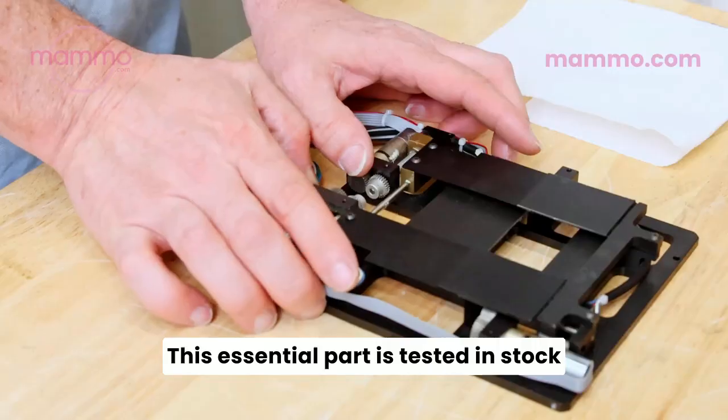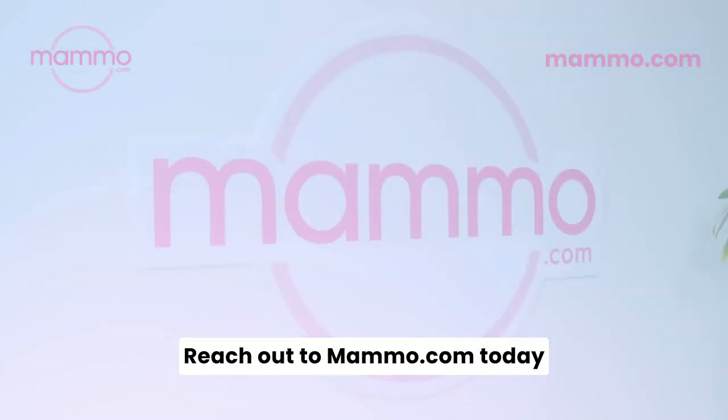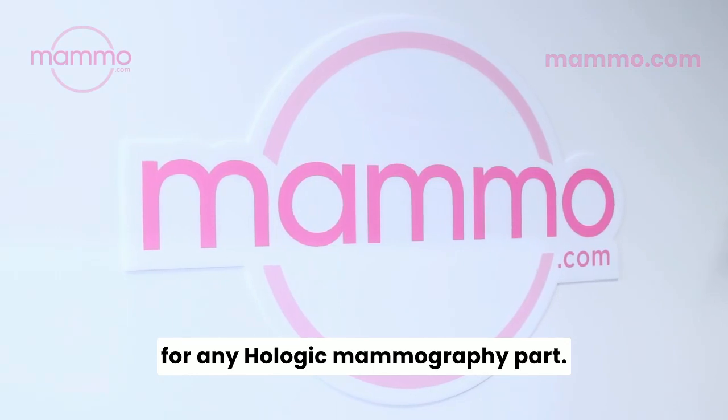This essential part is tested, in stock, and ready to ship to you overnight. Reach out to Mammo.com today for any Hologic mammography part.